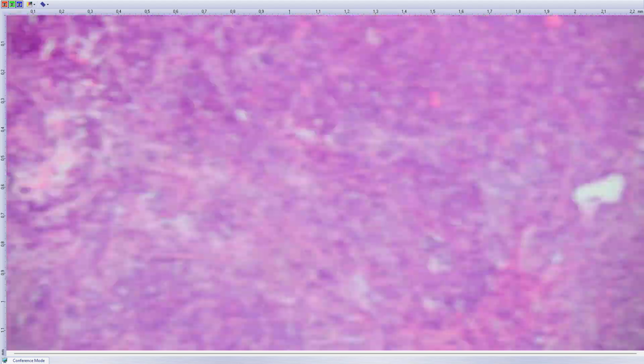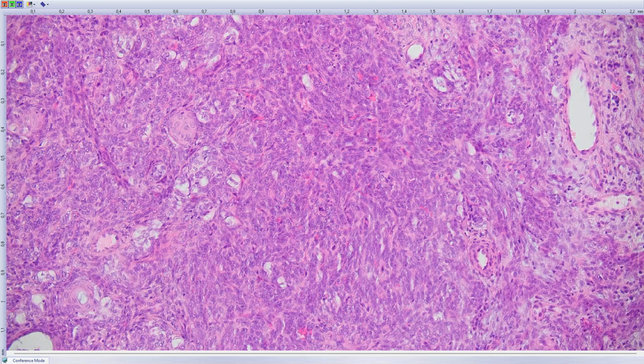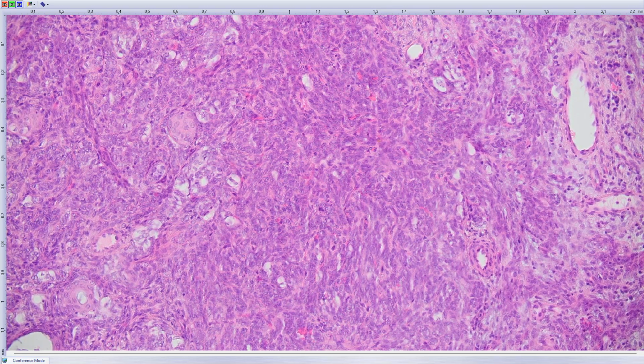And another component is spindle cell proliferation that looks like schwannoma or pleomorphic adenoma. The tumor was described by Rosai and Dehner under the name salivary anlage tumor. There is no known driving genetic mutation or fusion, because probably the panels of nowadays are not strong enough.